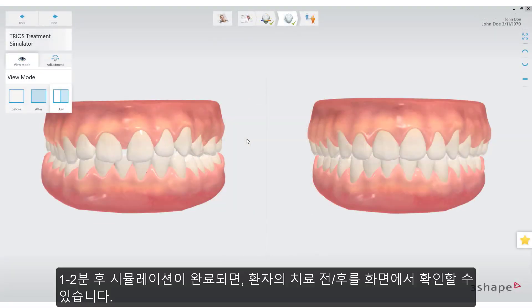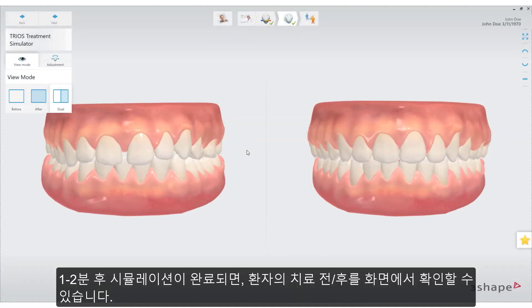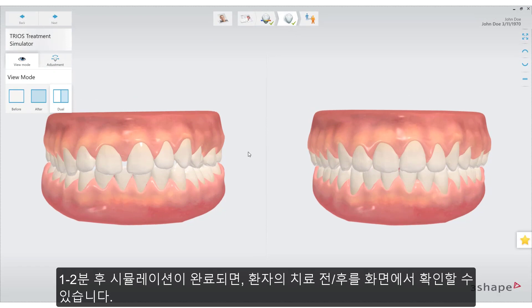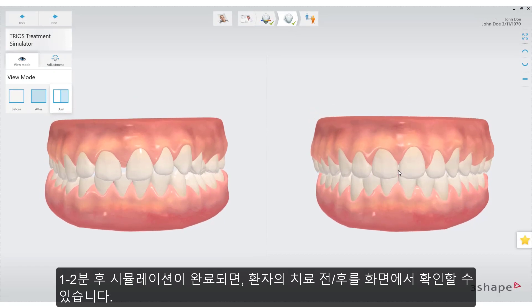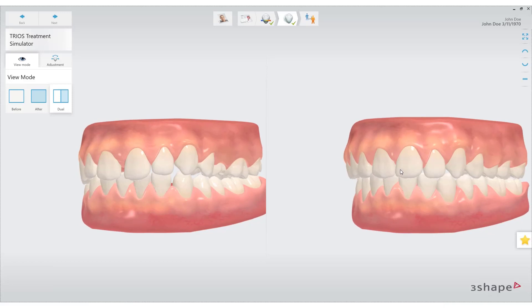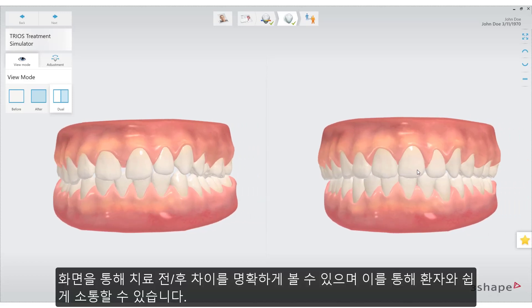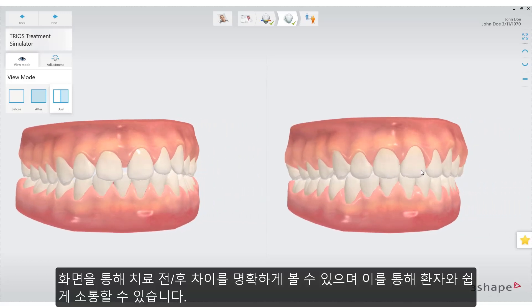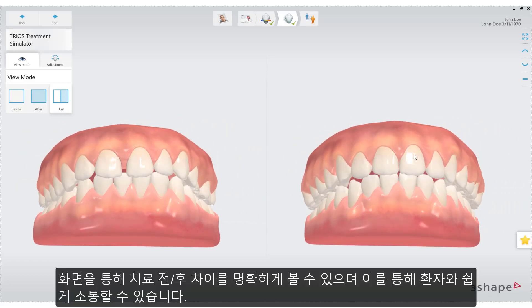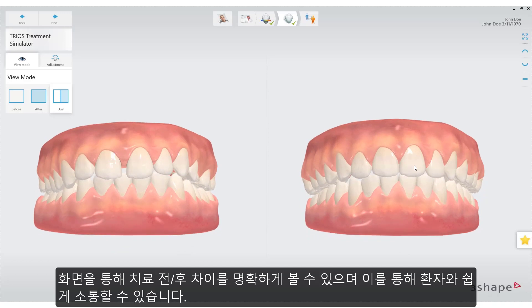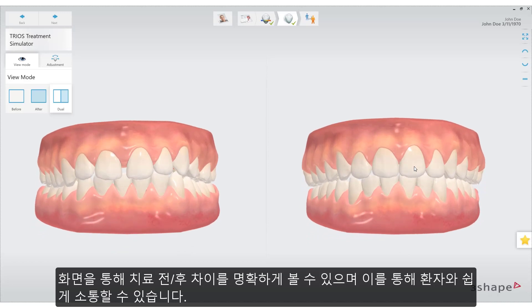Once processing is completed, after one or two minutes, the simulation is shown side by side with the original position of the patient's teeth. The differences between pre- and post-treatment can be clearly shown and communicated to the patient.